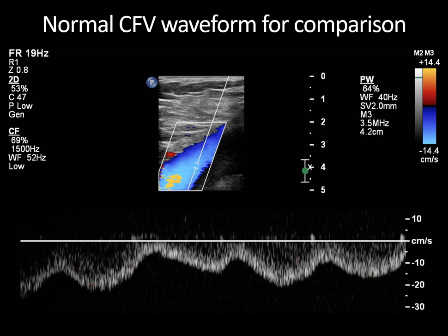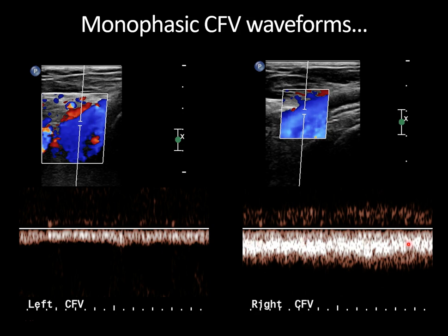When you see a more monophasic waveform, you have to worry about something interrupting the transmission of those respiratory variations to the vein. That's usually due to a problem with a more proximal vein, like the external iliac or common iliac veins — caused by DVT, extrinsic compression from a mass, hematoma, or lymphadenopathy, or May-Thurner syndrome where the right common iliac artery compresses the left common iliac vein, or intrinsic luminal narrowing from a prior DVT. With bilateral monophasic waveforms, you start worrying about IVC abnormality, bilateral iliac vein thrombosis, bilateral extrinsic compression, obesity, or large-volume ascites. The ACR practice parameters for peripheral venous ultrasound currently recommend looking at the contralateral common femoral vein waveform even if only one leg is ordered.